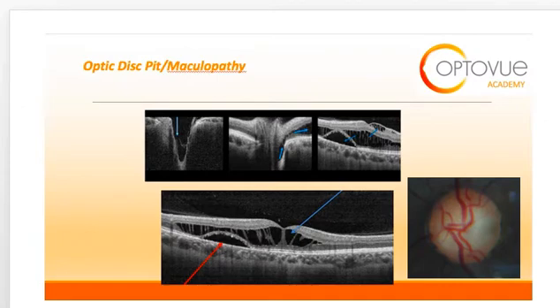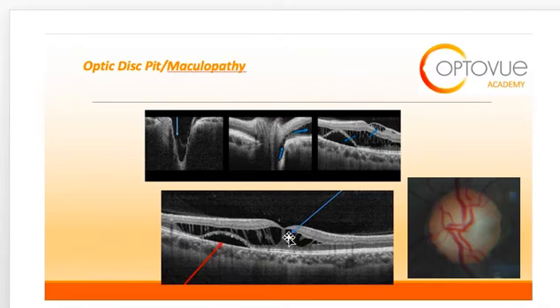The final entity I will discuss is that of optic disc pit and associated maculopathy. Optic disc pit is a rare congenital anomaly of the optic nerve head, and associated maculopathy is commonly reported. OCT of optic disc pit maculopathy can include subretinal fluid, as illustrated here with the red arrow, and schesis-like cavities as illustrated by the blue arrow. The outer retinal layers are often affected, extending from the disc to the macula.